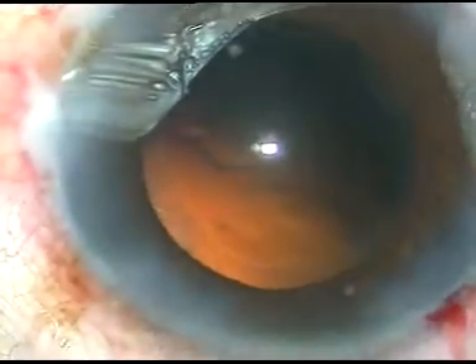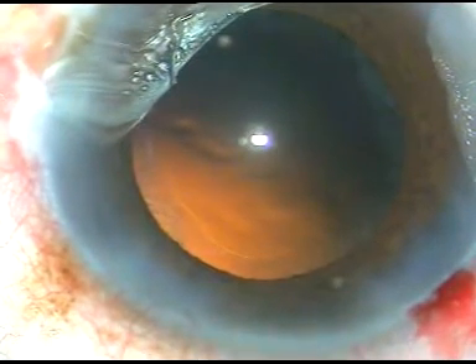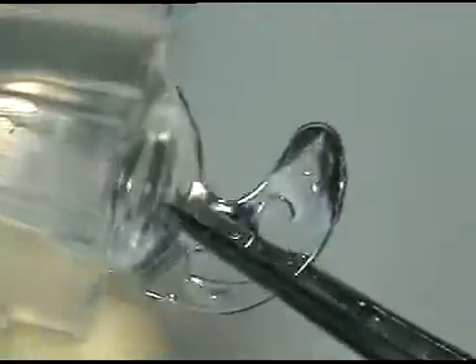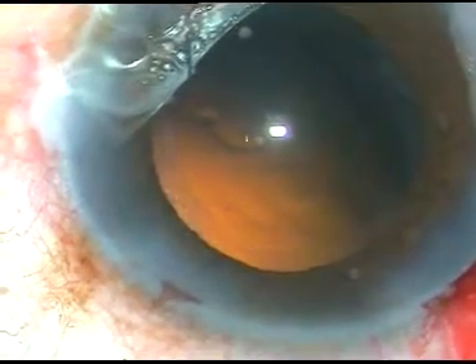Cortical clean-up has been done nicely and now it's time to implant an intraocular lens. This is the intraocular lens — it's a hydrophilic acrylic IOL, NASPRO from Appasamy. It's an aspheric lens. I have no financial interest, but I have a lot of gratitude for Appasamy — they have helped me a lot and gave me machines without any down payment in the past.